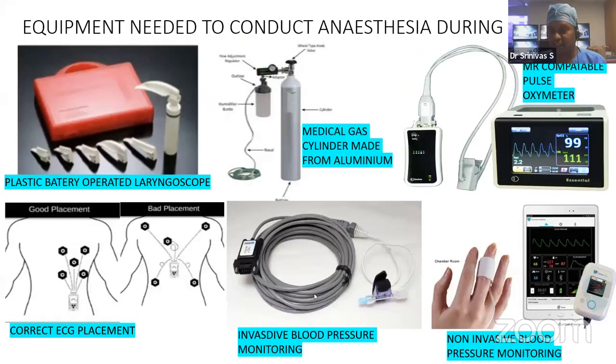So while conducting anesthesia in the MRI, it is very important to have this set of instruments present for the safety of the patient. These are a plastic battery operated laryngoscope, a medical gas cylinder made from aluminum, an MR compatible pulse oximeter, invasive blood pressure monitoring if required, and non-invasive blood pressure monitoring, that is a must. And while putting the ECG leads, this type of schematic representation of the ECG would give a correct reading rather than scattered ECG placement.